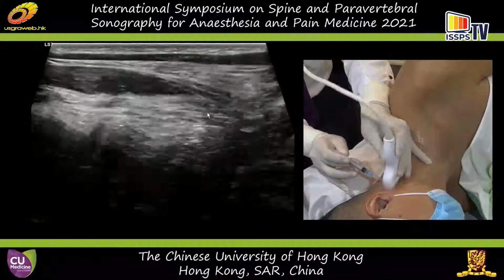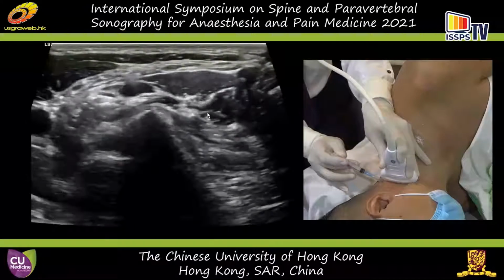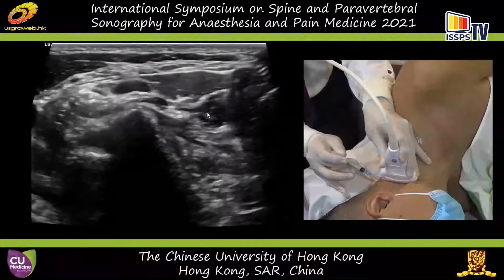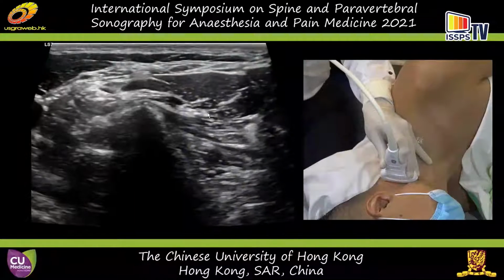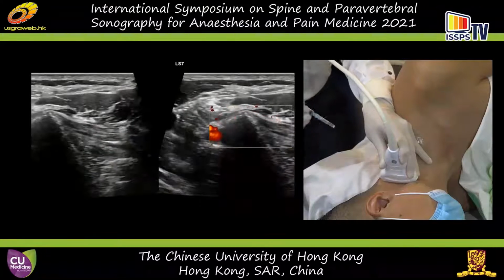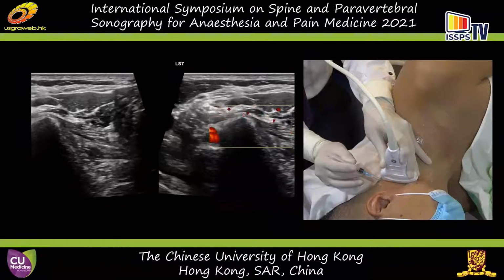When the needle enters the patient, you can turn to the long axis, the in-plane technique. Then you can see the whole trajectory of the needle to that facet and also the third occipital nerve. But you have to turn on the power Doppler a lot of the time, and then you can use the dual mode, and you can do your injection intra-articular or to the medial branch.